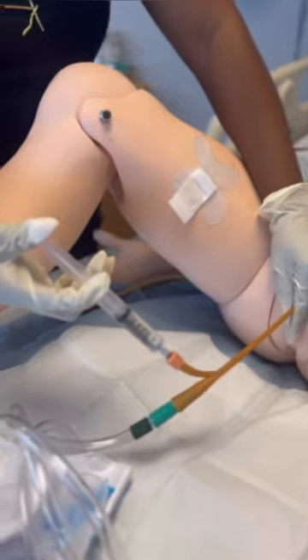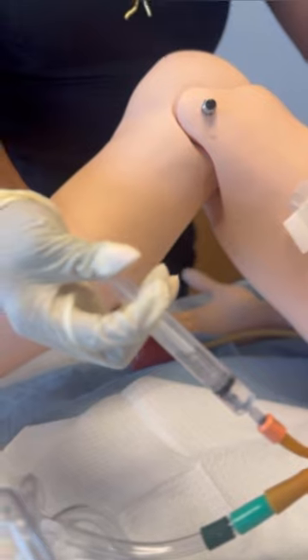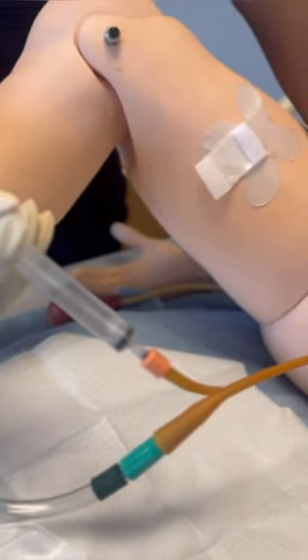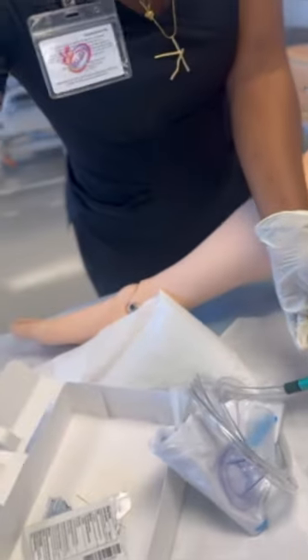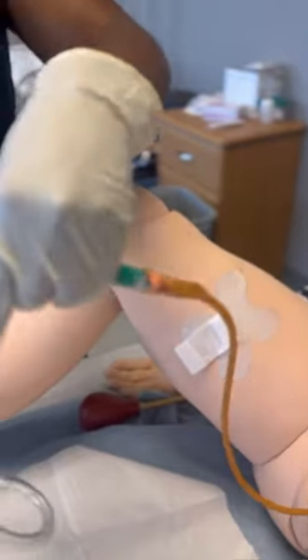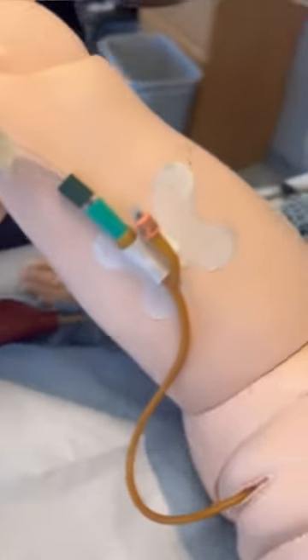With your sterile hand, inflate the balloon by pressing down on the plunger of the syringe. Once the balloon is inflated, let go of the catheter, give it a nice tug, let go, and unscrew — that ensures the catheter stays in place. At this point you are no longer sterile. Secure the catheter to the patient with the securement device, making sure you have enough slack so that it doesn't tug.